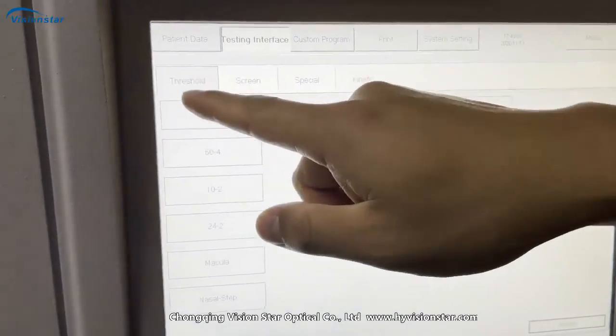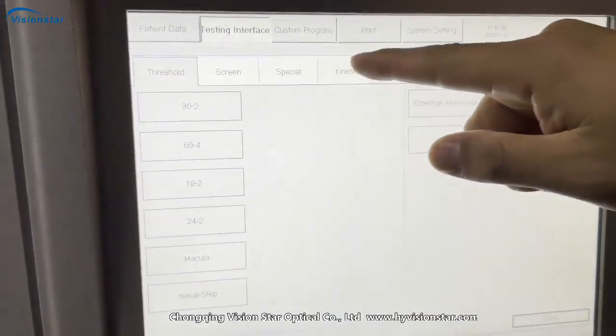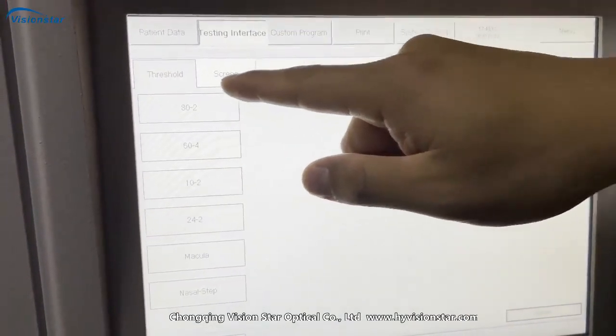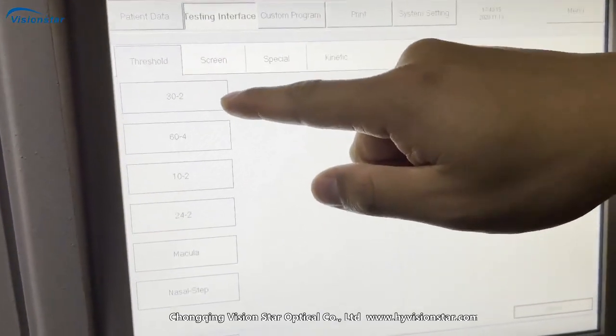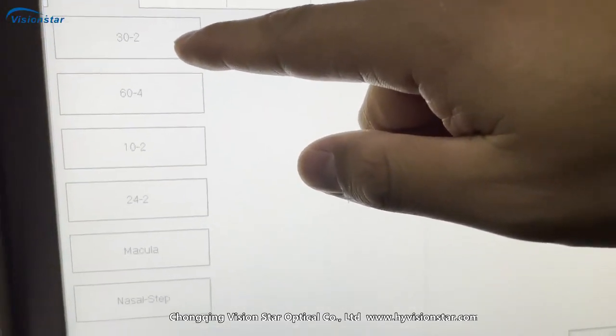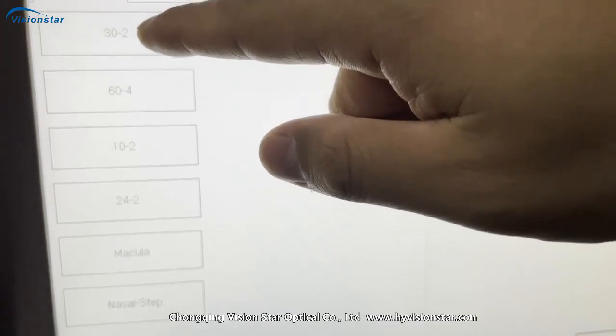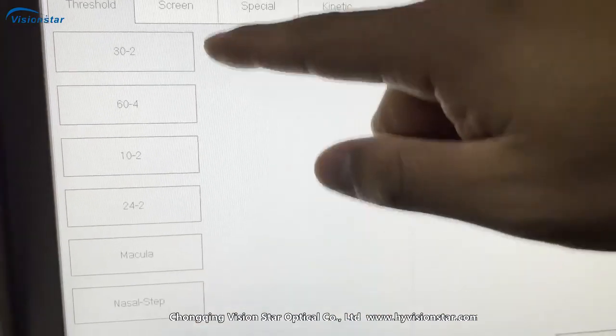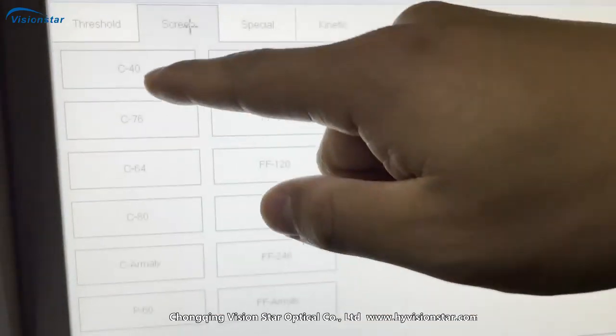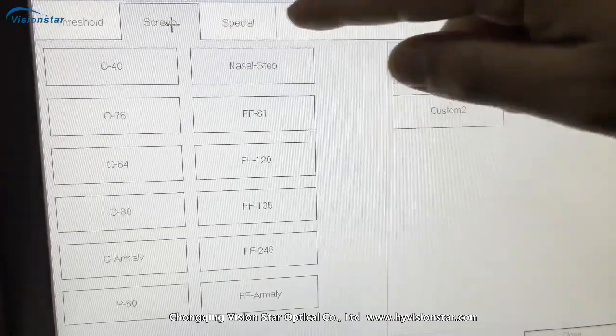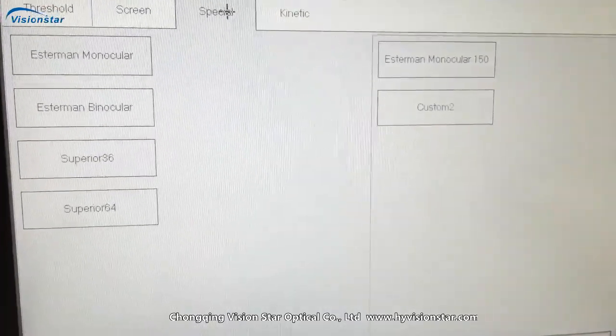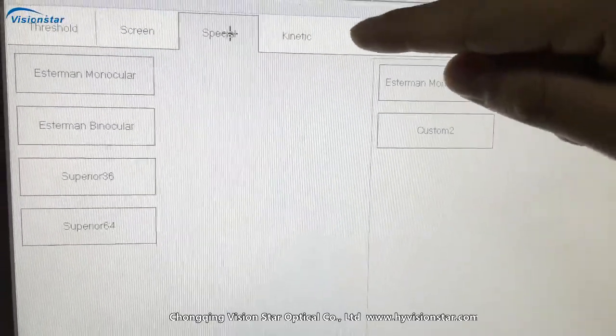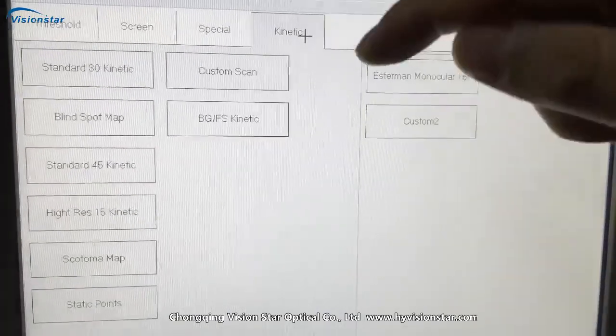Okay, you can see here, there are several different programs. Here, threshold, you can see scope, and this screen, you can see here. It's a special test. And this is kinetic.